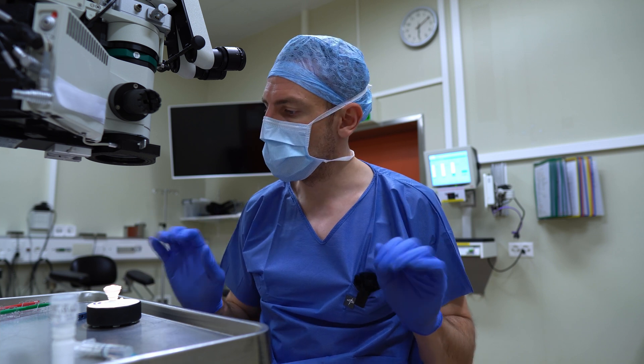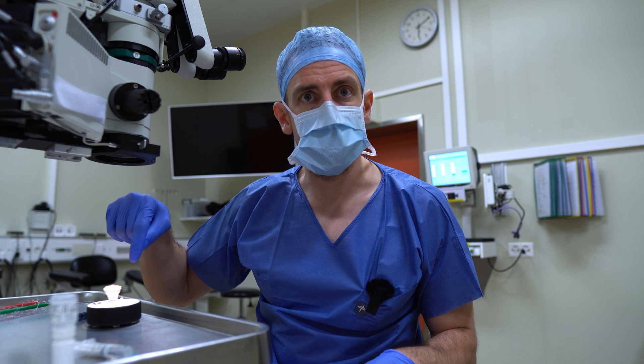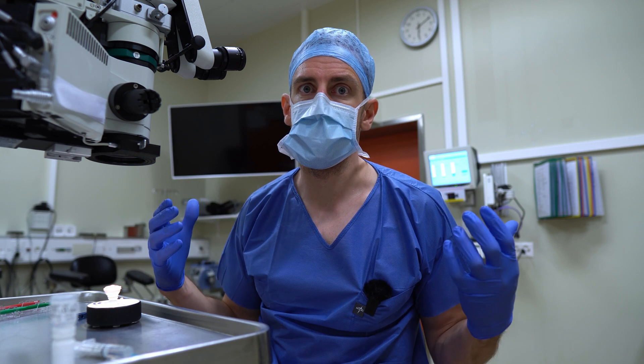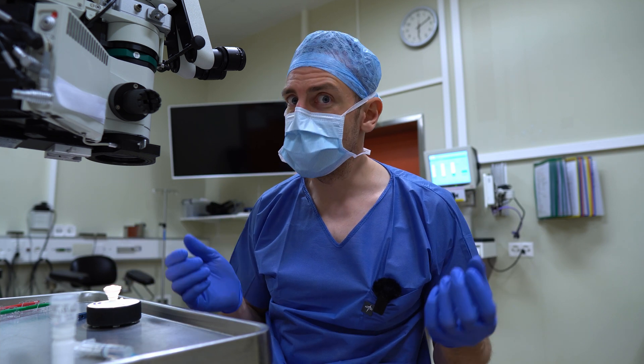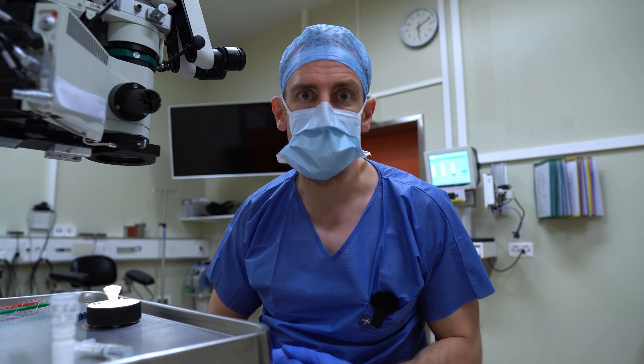Wow. This is the first eye that I've seen that you can actually put some viscoelastic on top of the cornea to give it that magnified, contrasty look that you get in a human eye. So now let's clean this up and check out what it feels like if you actually turn it to increase the pressure and make the rhexis run out.